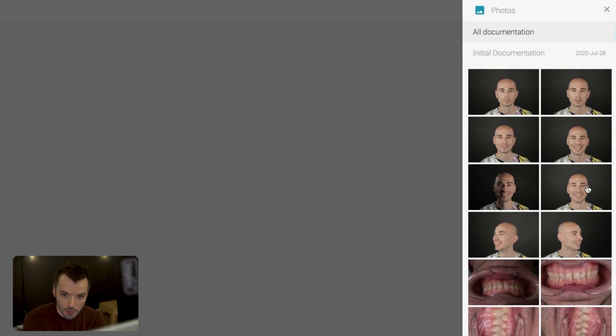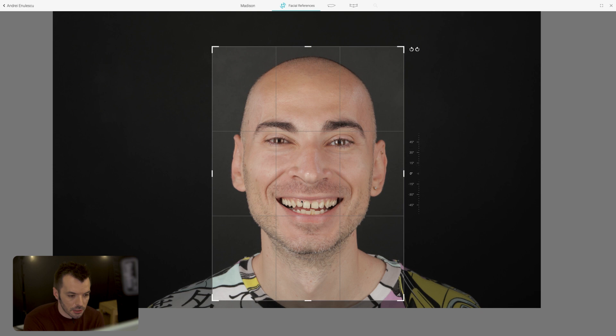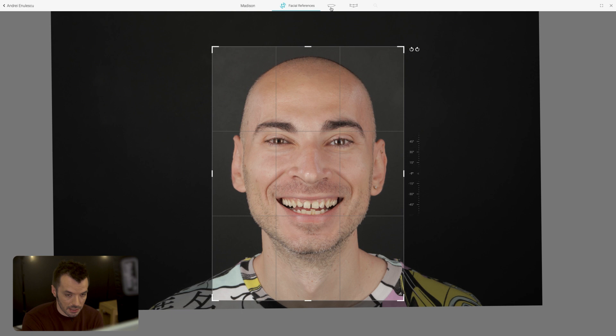Whenever I do a smile design, I always open the documentation and select the highest or widest smile, because you're going to have the largest amount of information in one place — you want to see as much of the gums as possible. The second you select the face, it will be automatically recognized by the system, which will automatically propose a crop and an alignment. You can go in and tweak it, but it's quite good as it is.